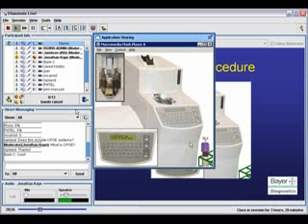This is now a physical procedure where someone is supposed to take the vacutainer and place a blood drop. They've already put this little needle at the top. Place a blood drop into this lab analysis equipment. They basically pick up the vacutainer, and as you see, sort of on the top left, you get a little crosshair there. When you know that you're over the spot, it's not going to teach the hand-eye coordination, but it is going to visually let people know where they're supposed to make the drop. And then once they make the drop, they pull it out, and that rotation is just happening automatically.